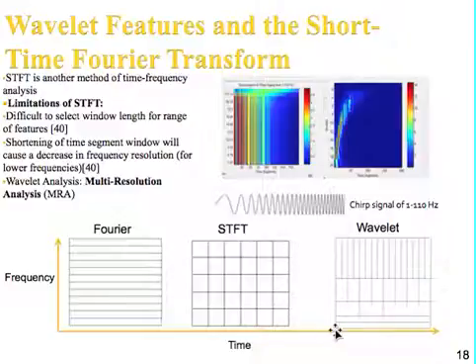For the wavelet transform at low frequencies, we choose a long window. At higher frequencies, we choose shorter and shorter windows, meaning we're going to get a broadening of our frequency, or less frequency resolution, for the short windows, and greater, finer frequency resolution for our long time windows, but less indication of how that changes or evolves over time. So these two figures just give an example.